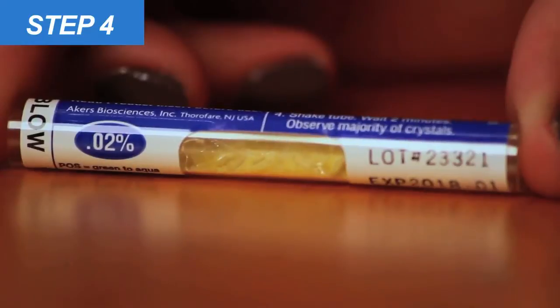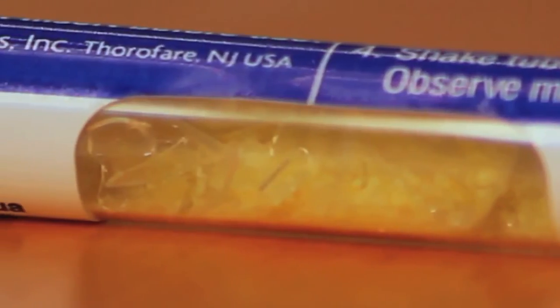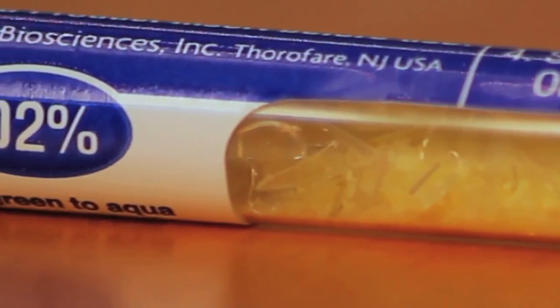Step four: shake the BreathScan alcohol detector side to side, then lay the tube on a flat surface and wait two minutes. When two minutes have passed, immediately look at the viewing window to determine the result. If the crystals are yellow, the subject's alcohol level is below the number stated on the detector.